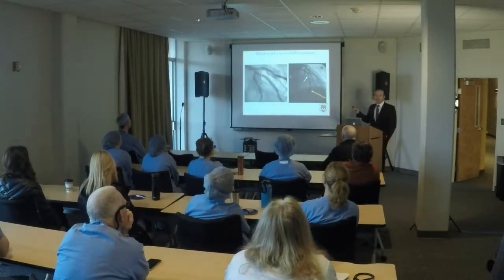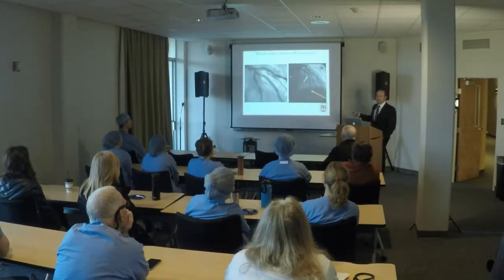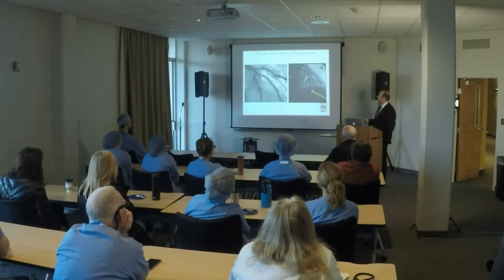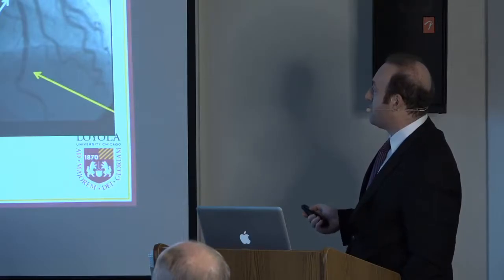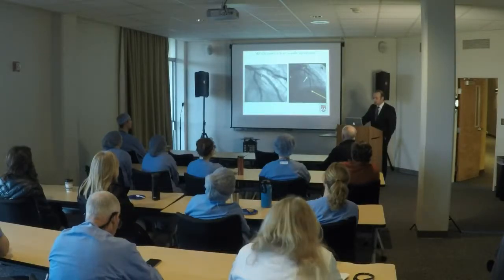Now, I'd like to go back to these two cases just to see if people were paying attention or listening. Which one of these vessels is ischemic? Is it this one or is it this one? The one on the left, exactly. So despite the one on the left having a QCA of only 36%, okay, this patient had a large aggregate plaque volume with evidence of adverse plaque characteristics that we talked about earlier, and this was an ischemic vessel as compared to this, which had a much tighter stenosis that had an FFR that was negative. So more to the story than stenosis.